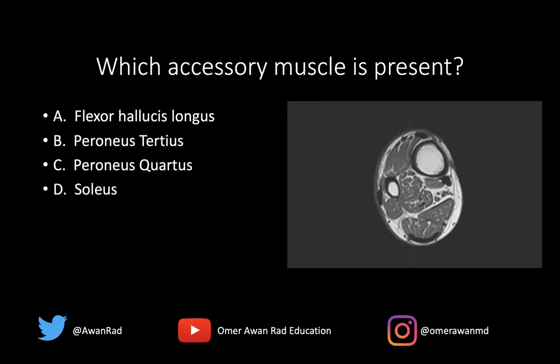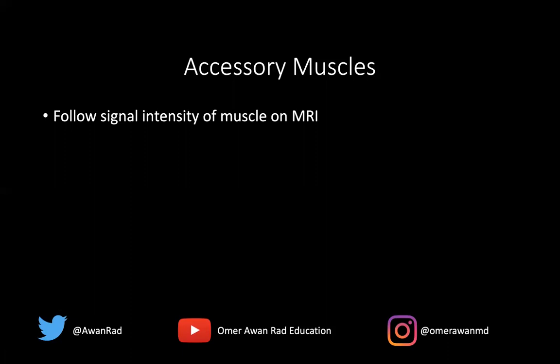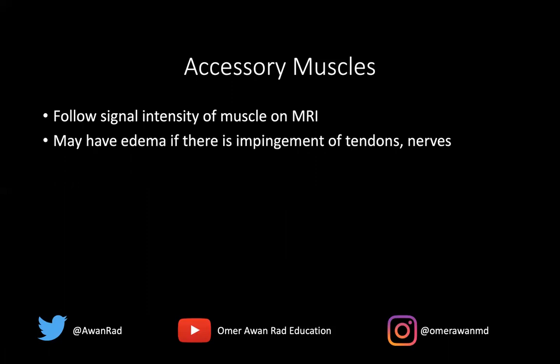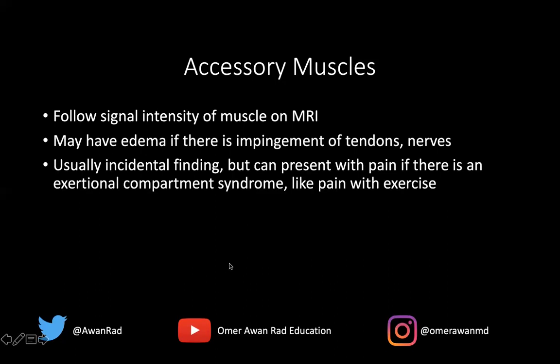We see this from time to time. There are many accessory muscles in the ankle, so I want you all to be aware of that. Accessory muscles follow the signal intensity of muscle on MRI — they look just like any other normal muscle. They may have edema though; sometimes on T2 there'll be T2 hyperintense bright signal, particularly if there's impingement. If a specific nerve or tendon is being impinged, that can result in edema and also exertional compartment syndrome. With patients who have pain with exercise, it's a confined space and can result in a functional exertional compartment syndrome, which is why accessory muscles can be clinically significant.